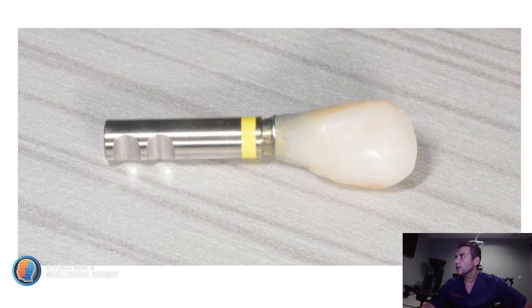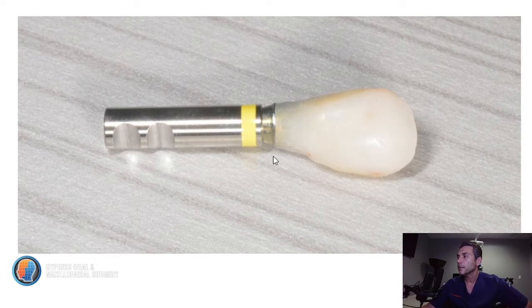First step is we actually take the temporary out of the mouth. That's number one. Number two, this is an implant analog, and we screw the temporary into the analog. Now, one thing I want you to be very careful with: when you screw them in, don't make them very tight, because otherwise a lot of times when you try to unscrew them, this analog will spin in the impression, and I'll show you what I mean by that.